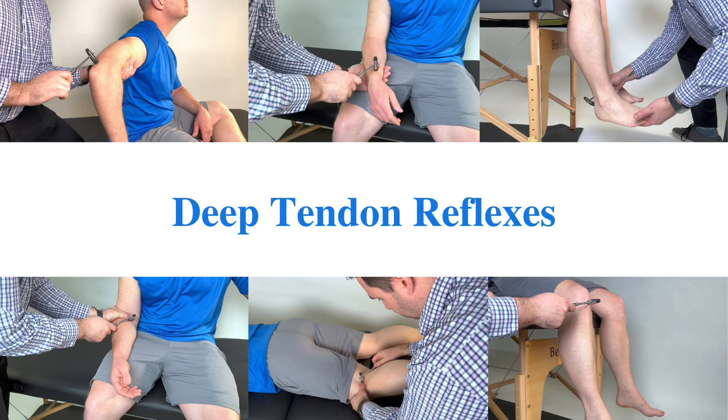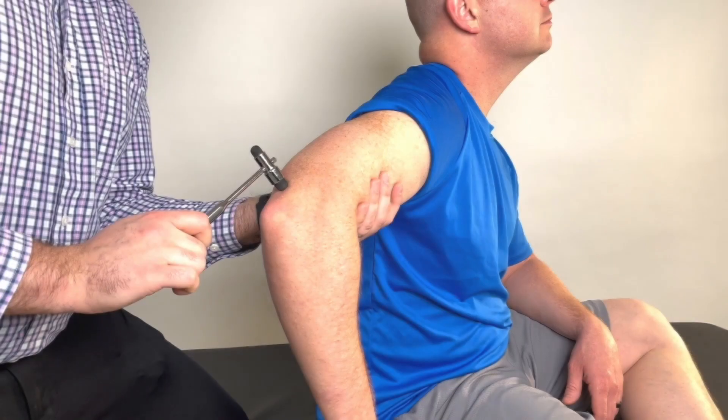Begin by palpating for the target tendon. Make sure the patient is in a relaxed position, then quickly strike the tendon with the reflex hammer to elicit a quick stretch. For the tricep, support the patient's arm into 90 degrees of shoulder abduction with the elbow flexed to 90 degrees.